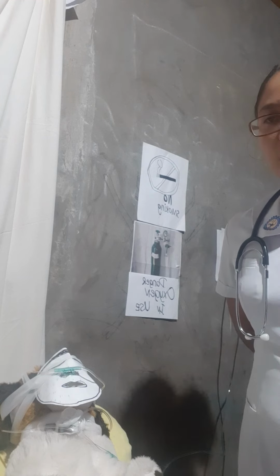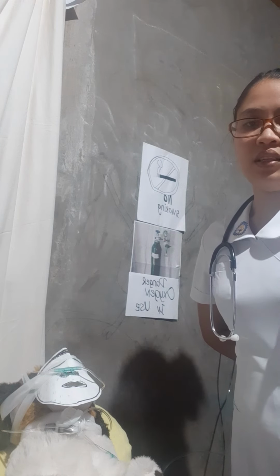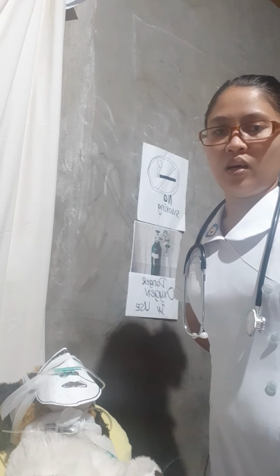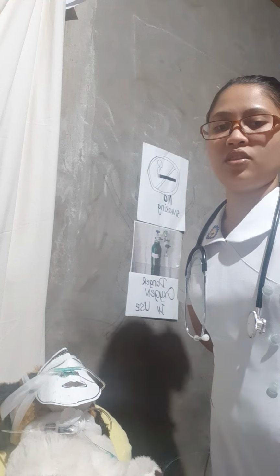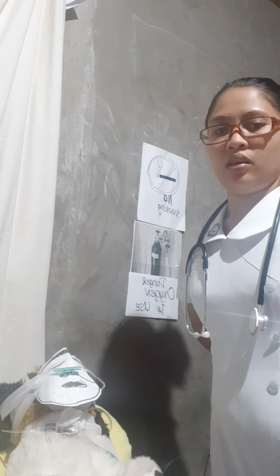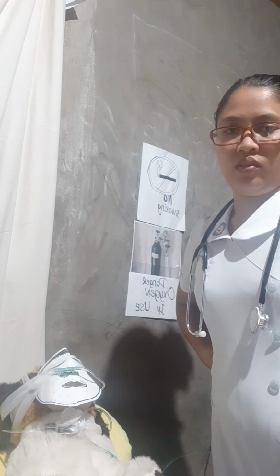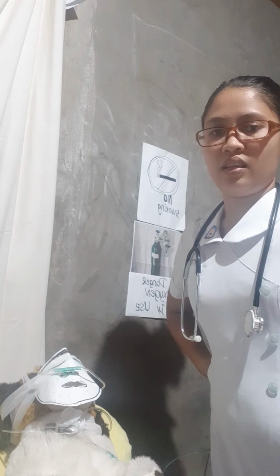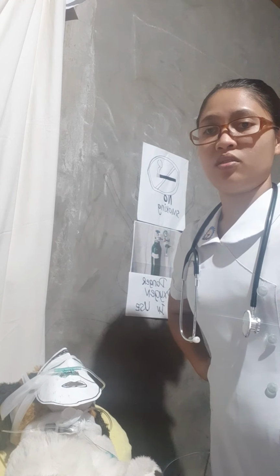Before, the client's vital signs were: BP 140/80, temperature 36.5, respiratory rate 30, pulse rate 110, oxygen saturation 90, and the catheter is an open tip catheter, French 16, then portable unit gauge 15 millimeters of mercury as per doctor's order.